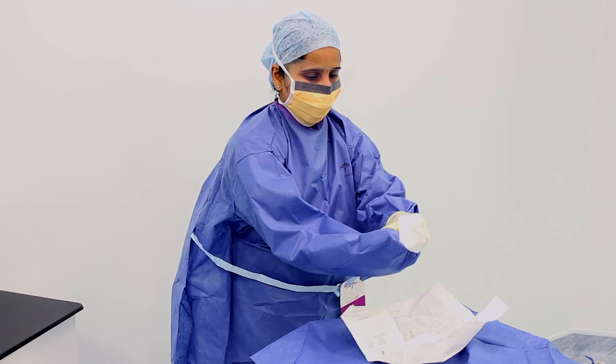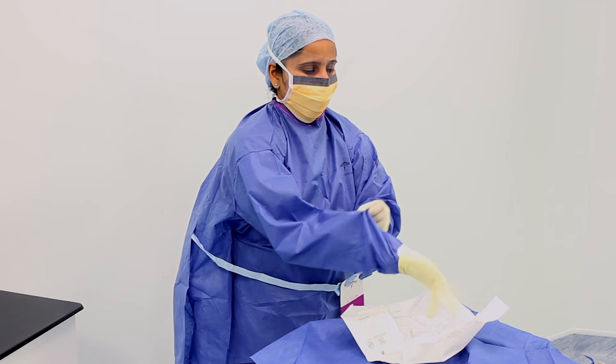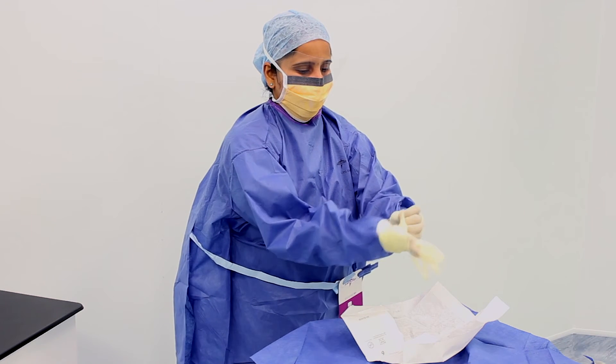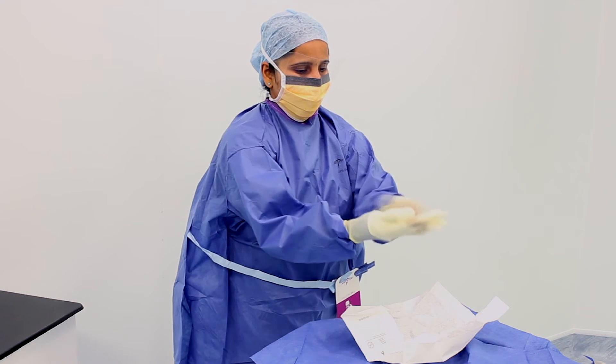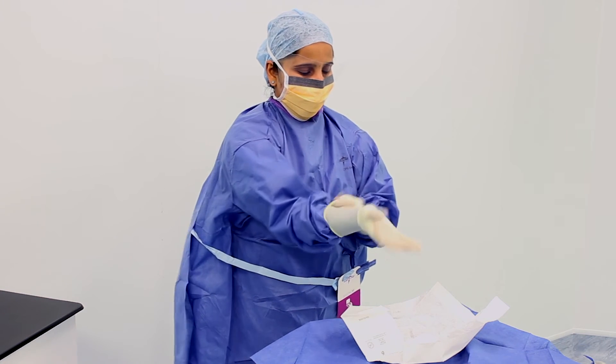We then repeat the same process to don the right glove. The benefit of the closed gloving technique is that at no point are the outer surfaces of the gloves touched by the hands. This helps significantly to reduce the risk of desterilizing the gloves.